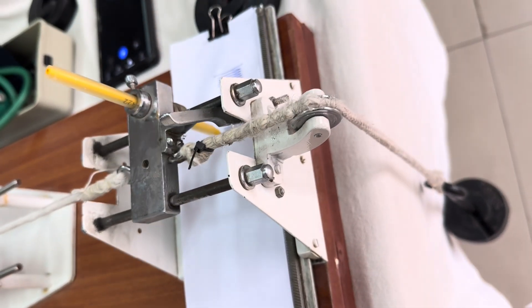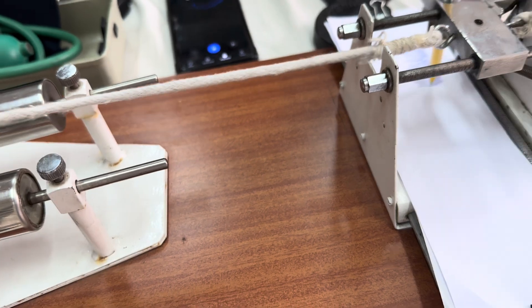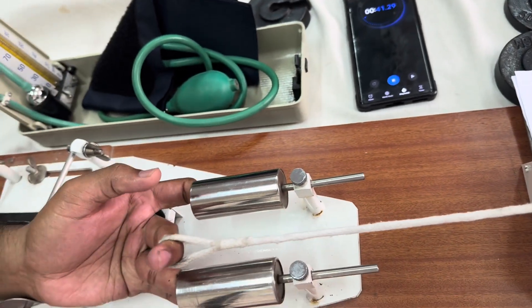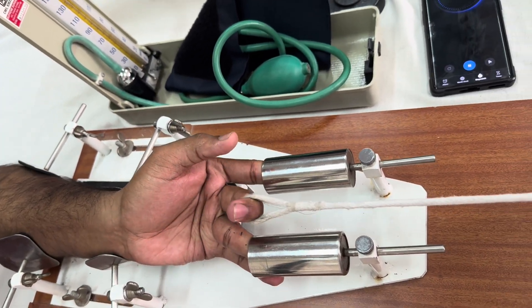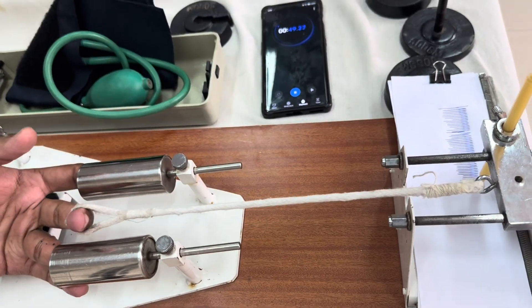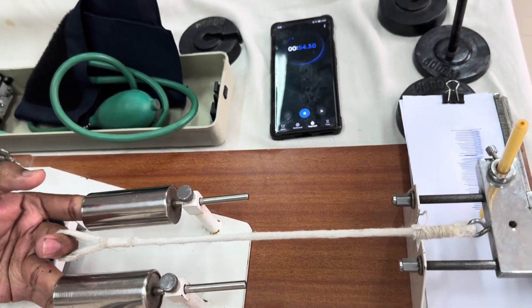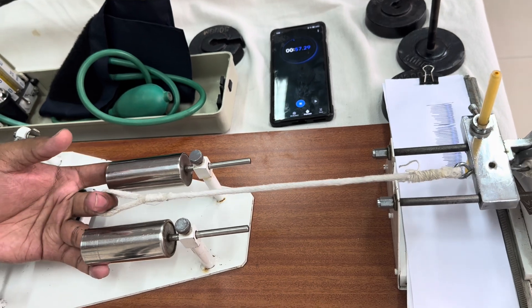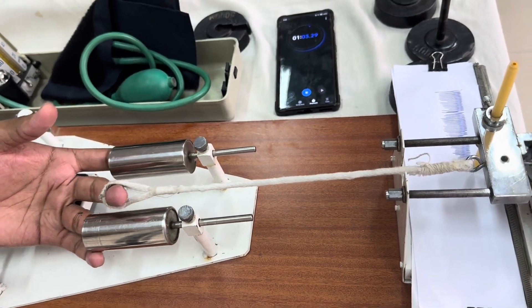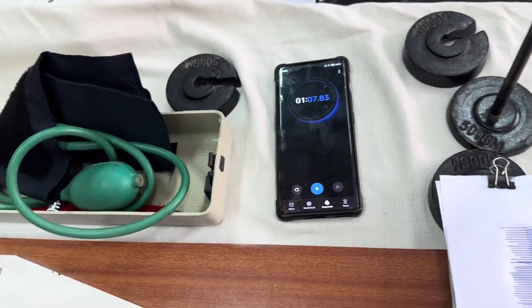The weight is being lifted and we are simultaneously recording it. We should record until the person becomes fatigued and is not able to lift the weight. They should maintain the frequency of one contraction per second, and we also need to note the total duration for which the person is able to perform. Now it is almost 55 seconds and the person is still doing it. As long as they can do it, we continue. Now the person has stopped — it was one minute and five seconds.